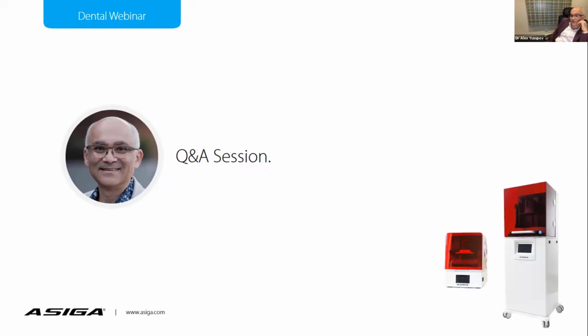There are a lot of workflows that you create, and you're basically just hammering little bits together to make it work. But it is becoming less and less of a problem than it was 8 years ago, when we first started using 3D software in a big way. There were a lot of disconnected parts, and the move is now to make things more and more connected.